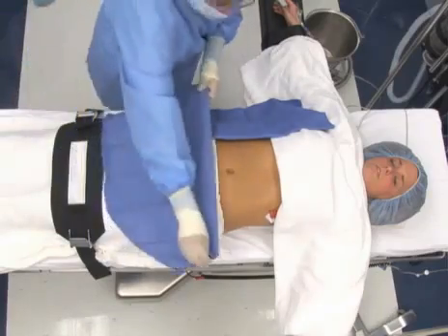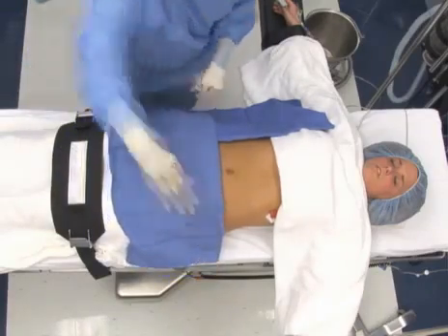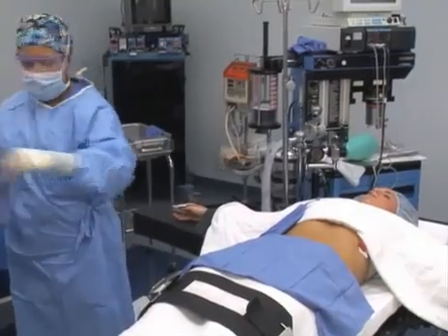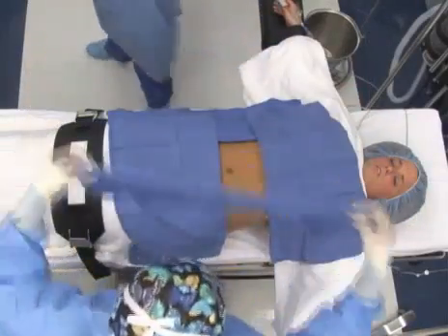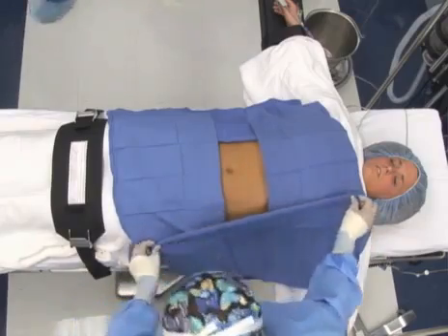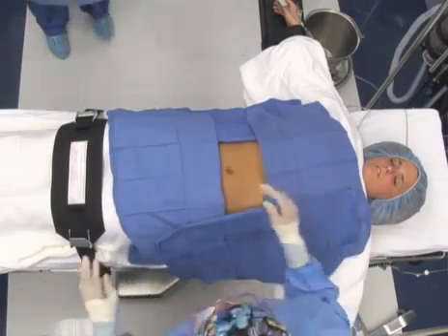Framing the incision means providing an opening in the drapes for the incision. The open area inside the frame is called the fenestration. The fenestration can be square, oblong, or oval if a disposable fenestrated drape is used.